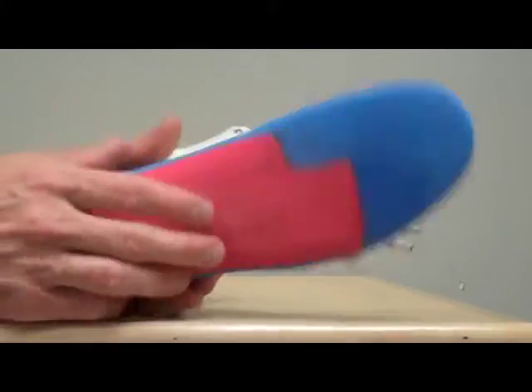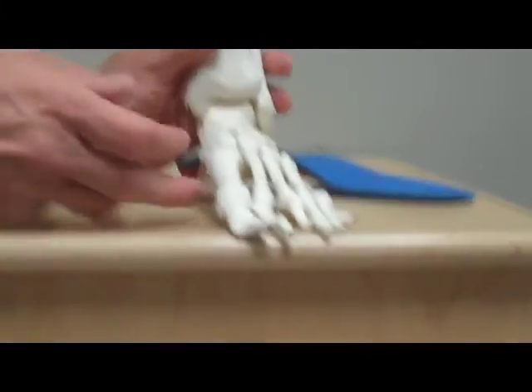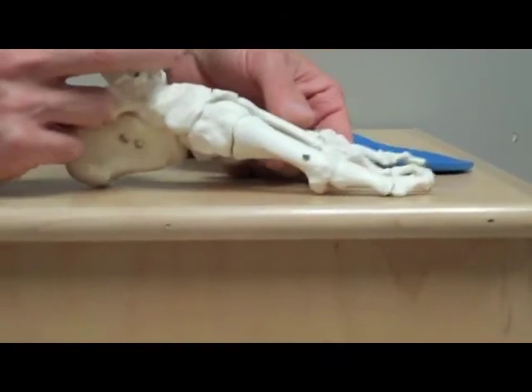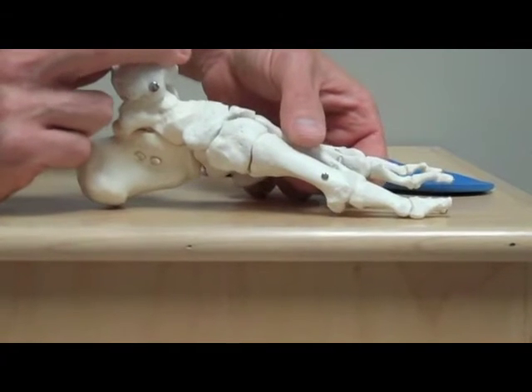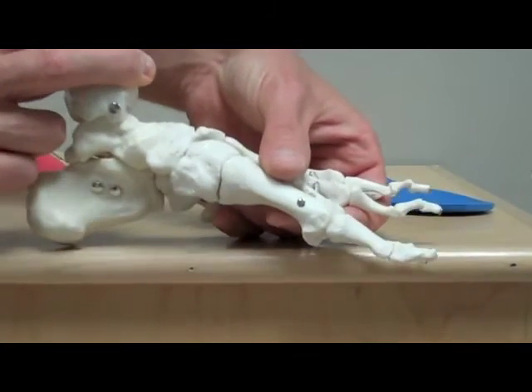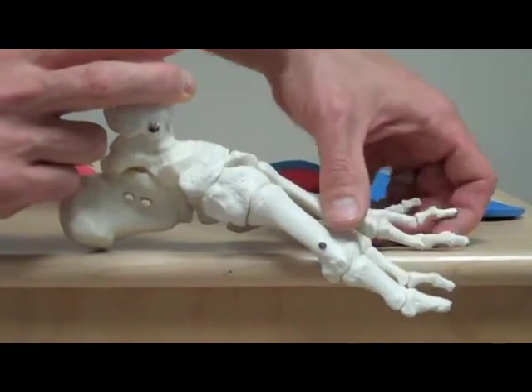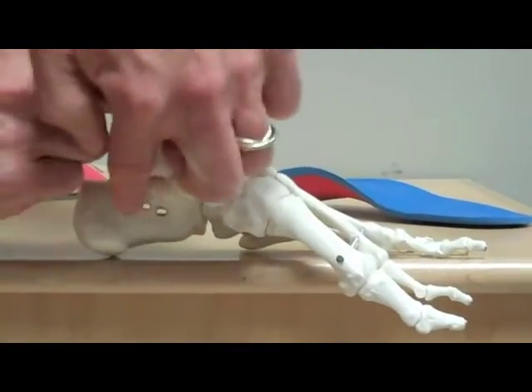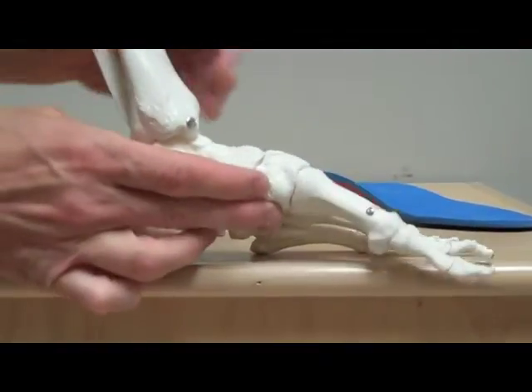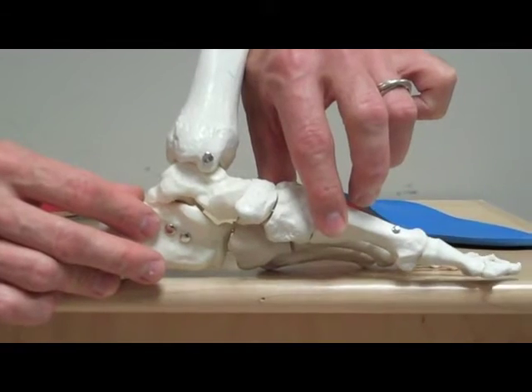So if you really think about this from a biomechanical standpoint, I guess really almost a common sense standpoint, if you pick this side up and let the first metatarsal go down, it's almost like you're slackening the tissue. The whole idea of the big toe dropping beneath the level of the platform I'm on here, it actually in a sense brings this metatarsal head closer to the heel. Versus if we do just the opposite and raise this up higher, so this whole foot raises up, and we do a post this way, it's almost like you're stretching that fascia a little bit more.